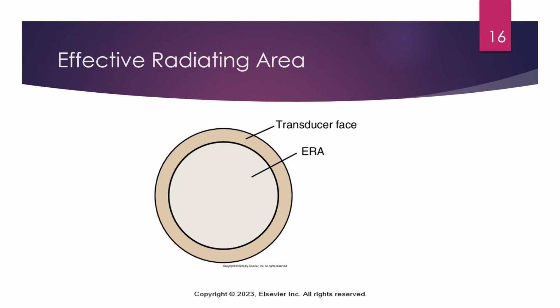So if you have, let's say, this ERA of 5 centimeters, you can only move about 10 centimeters to 15 centimeters max for the entire treatment area. So we're looking at localized small areas of the body in order to really effectively heat it or produce those tissue healing responses that we're looking for.